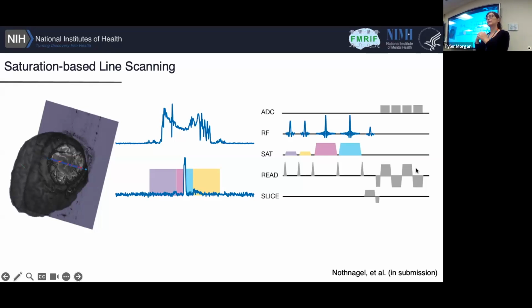So this is really commonly used. It's not a really specialized technique. Saturation pulses are used for a lot of anatomical imaging in places that are hard to image, places like the spine or in body imaging, where you want to really avoid something. But we're using it for a totally different purpose. This is essentially to cancel out all of the brain tissue that we're not interested in. And you can see here, in the latest version of what we've been doing, we have 4 different saturation pulses in order to effectively cancel out all of that signal without also accidentally canceling out the part that we are interested in.